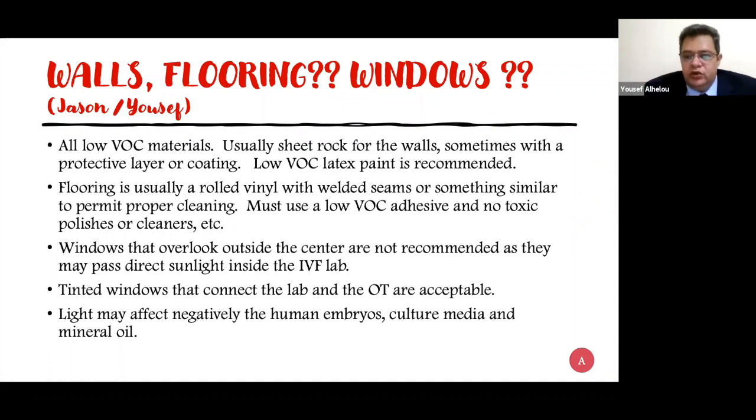For the walls, we used stainless steel panel cladding. If you take a cross section in this, it looks like an ice cream sandwich. Like you have 2 stainless steel boards at the sides, and in the middle there is a styrofoam. And it has a lot of advantages.